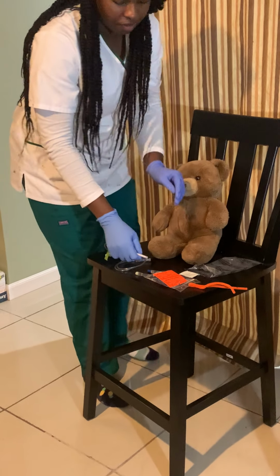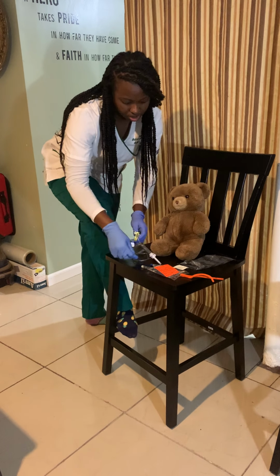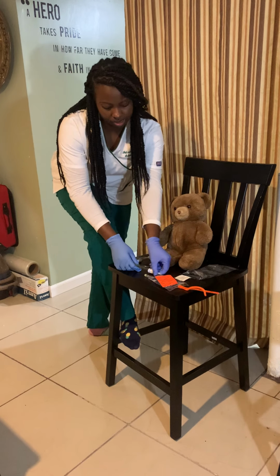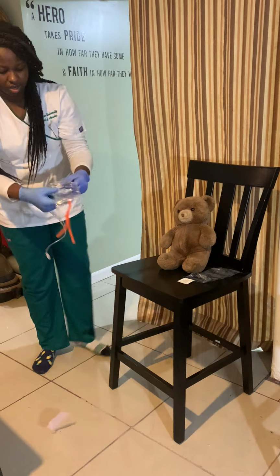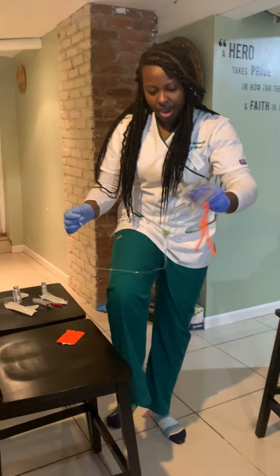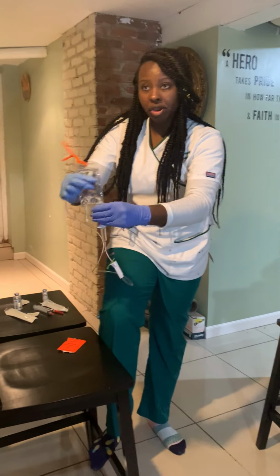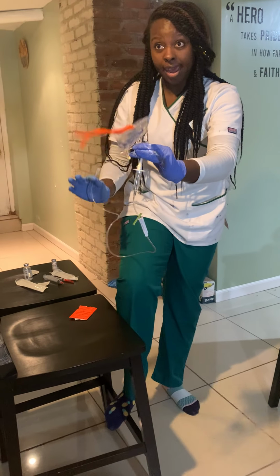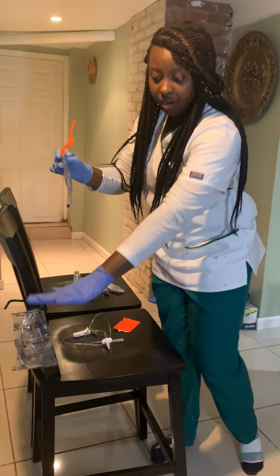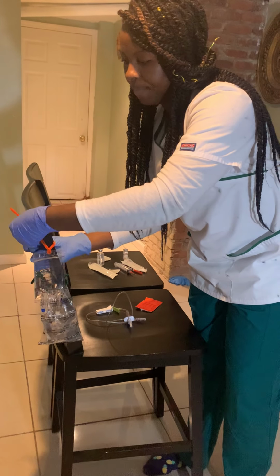And then I will make sure before I move on, because this is a new tube, that I'm going to clamp it shut. And that's very important. Okay. So it is clamped shut. I am going to prime the tube now by letting some flow down in order to make sure there is no air bubbles. Now I'm going to hang the piggyback pouch higher than the current IV drip that's going on currently. Okay.